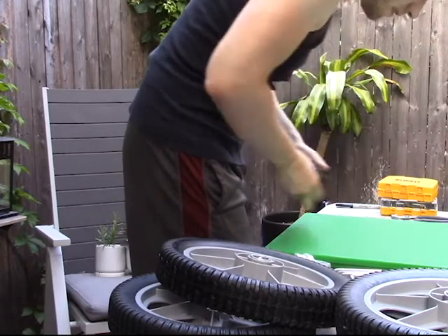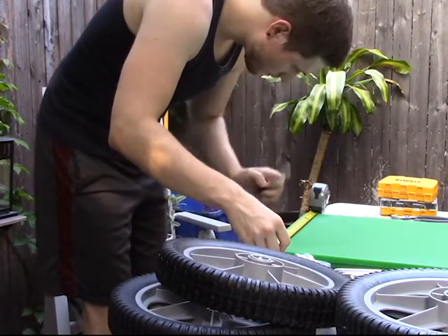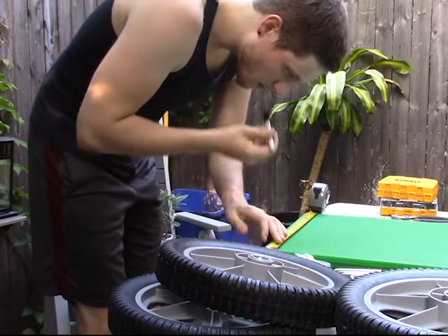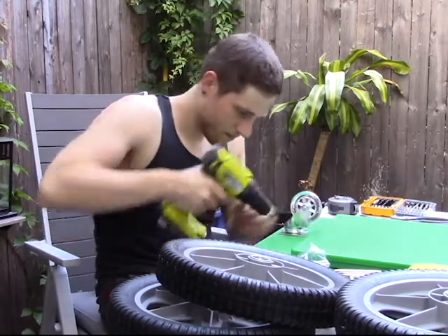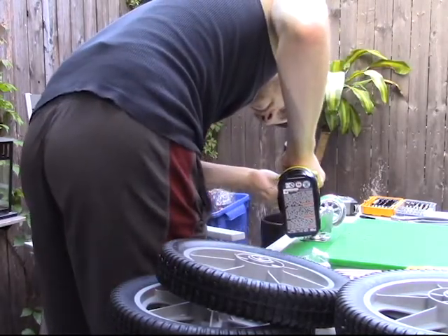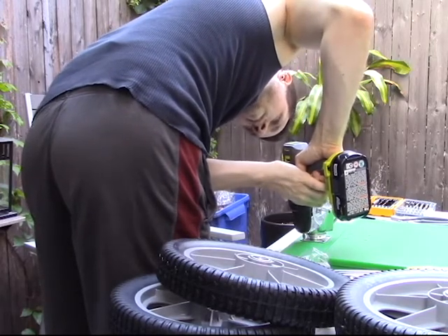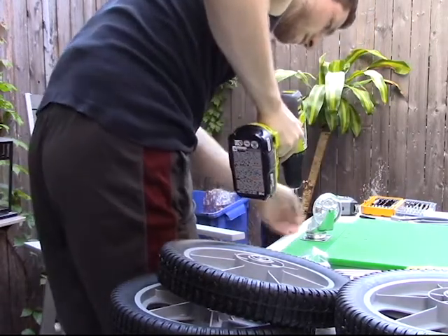Before you start this build, it's important to measure. We first measured to put the caster wheels in the middle, because you can make this build with just two caster wheels. However, after talking to the physical therapist, we decided to redo it and use four casters, one on each corner. The structure is stable with just two, but the children we were working with needed extra support.